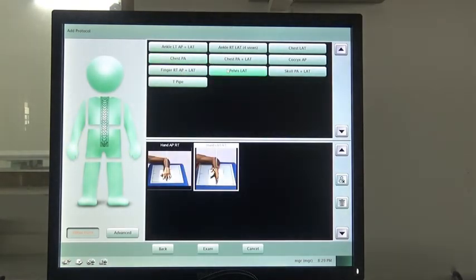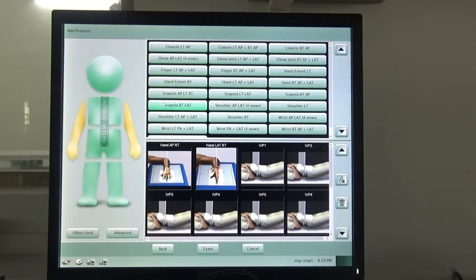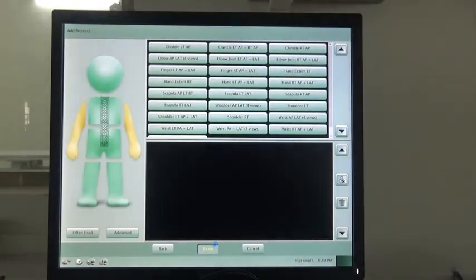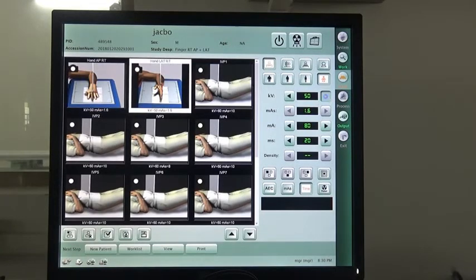The most advanced feature of our software is that it can teach you how to position the patient correctly. Choose a different body part and you will see a positioning guide image. Choose one and press XM. You will then see this page, where you can adjust the kilovoltage, milliampere, and milliseconds according to the specific requirements.